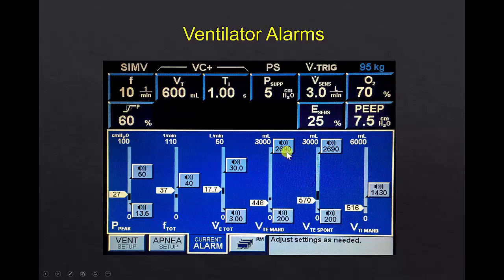Well, as you can imagine, these alarms are tricky. They're managed by respiratory therapy and they have to be set up. If they're set too sensitive, they'll ring too often and you'll get alarm fatigue. People will just ignore it. And if they're not set tight enough and they're insensitive, you can miss an important event such as a disconnect or mucus or tube changes that would cause high peak airway pressures. So setting these ventilator alarms is really an art.